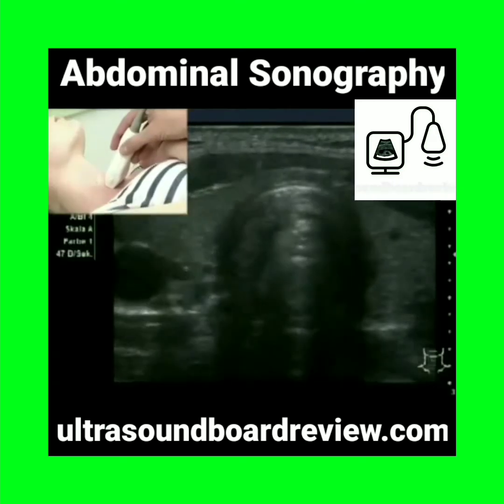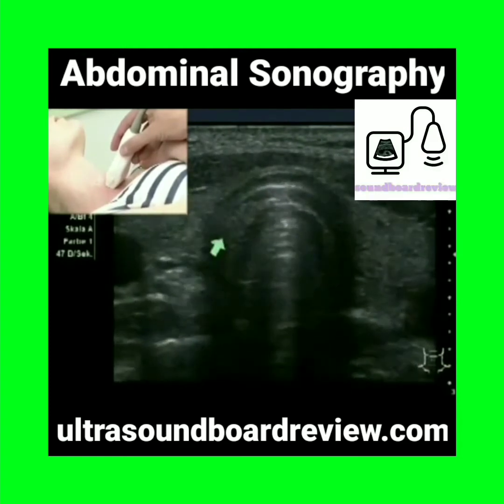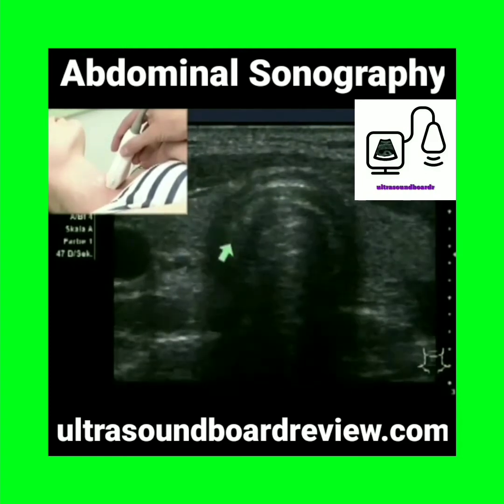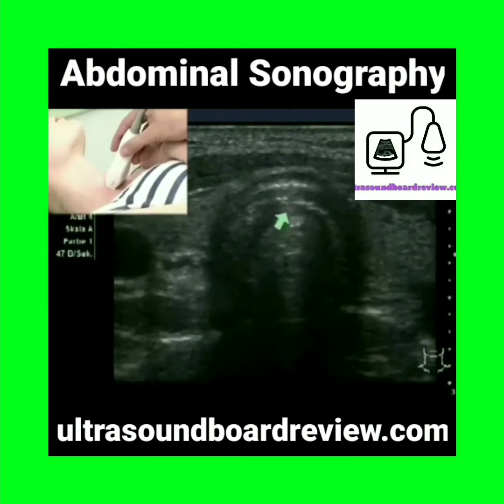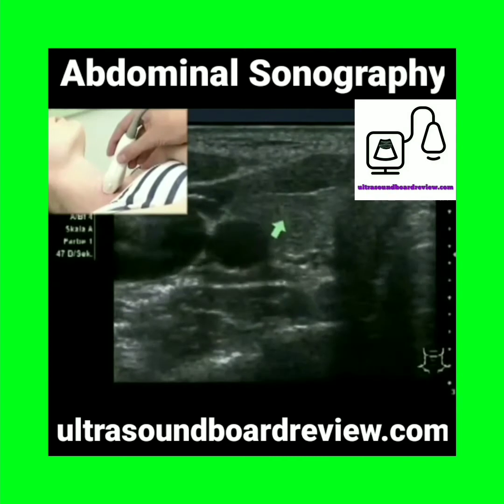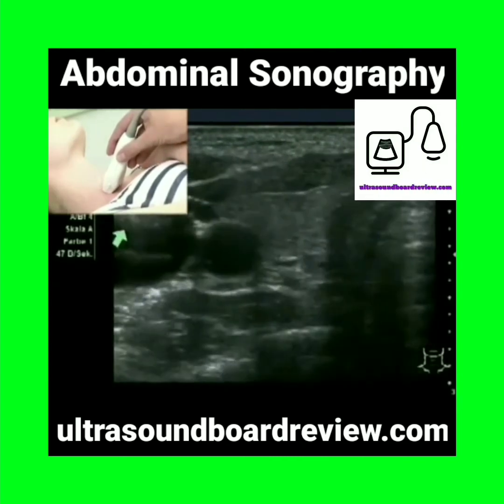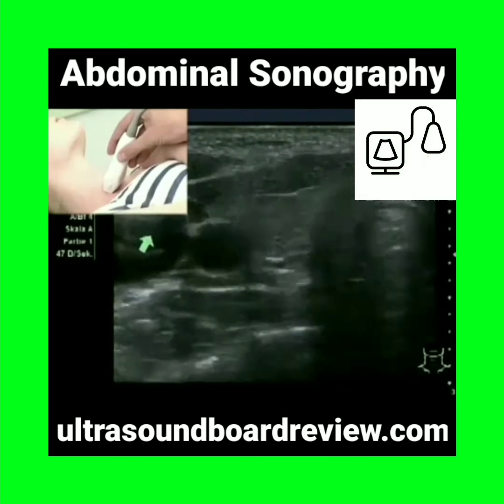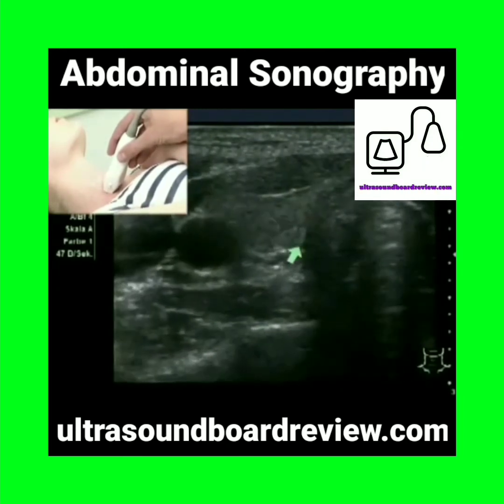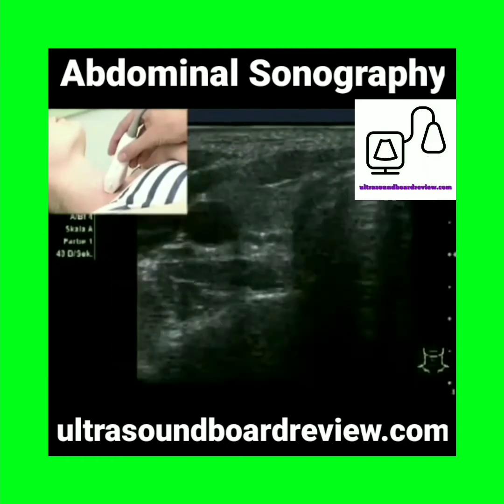We start the cervical examination with the trachea with air shadowing phenomena in the center. Shift the transducer to the right side. Identify the common carotid artery and the internal jugular vein. Centralize the thyroid gland. Increase the magnification factor.